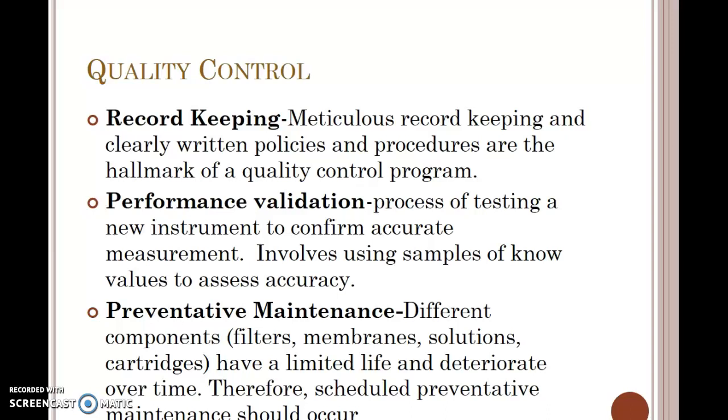It involves using samples of known values to assess accuracy. Preventative maintenance checks out different components, so filters, membranes, solutions, cartridges. They all have a limited life and deteriorate over time. Therefore, scheduled preventative maintenance should occur on blood gas machines.